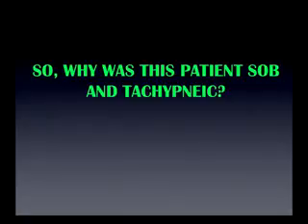Why was this patient so short of breath and tachypneic? This was discussed after the first ultrasound was obtained, which showed no pneumothorax and showed a chest tube was not necessary. Further ultrasonography was utilized.